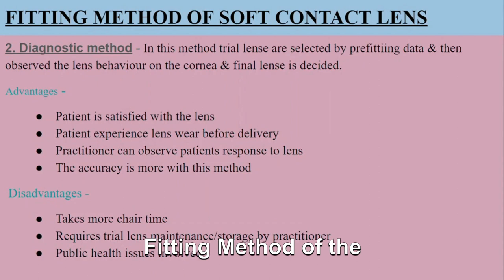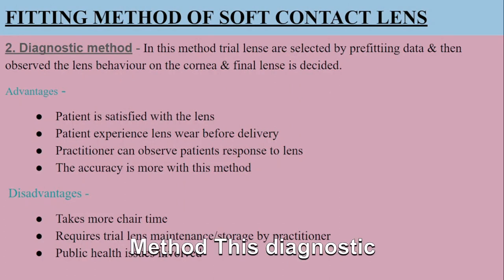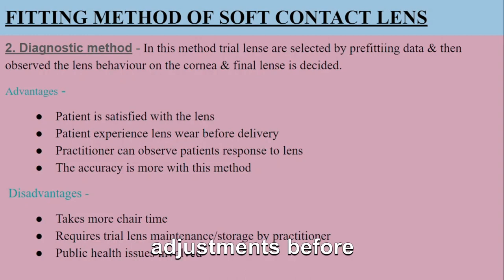Fitting method of the soft contact lens, especially the diagnostic method. The diagnostic method involves using trial lenses based on pre-fitting data to observe the lens behavior on the cornea. This method allows the practitioner to assess the fit and make adjustments before determining the final lenses.